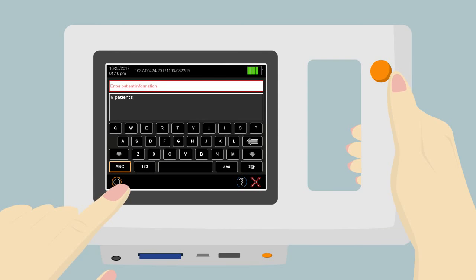To be able to uniquely identify a patient in the database, enter the patient's name plus date of birth or patient ID plus date of birth via the screen keyboard. As an option, examination location and/or contact information can also be saved in the database. Simply enter the patient's personal data separated with a space character via the screen keyboard.